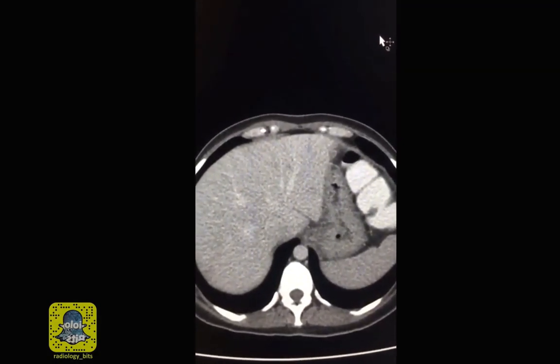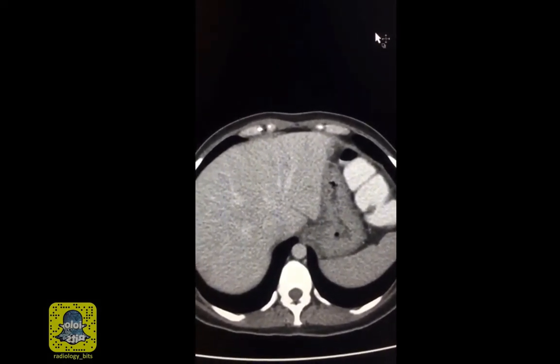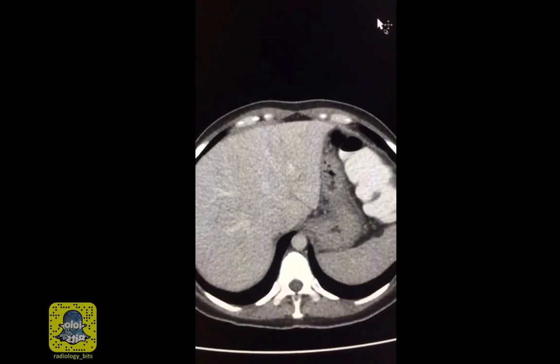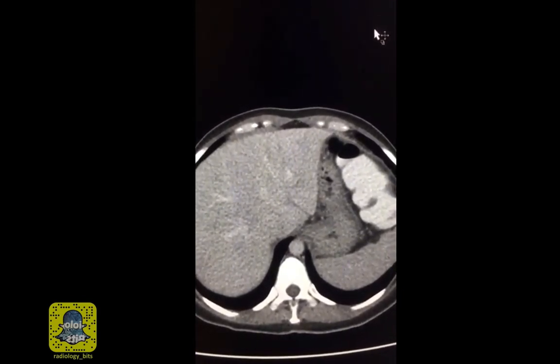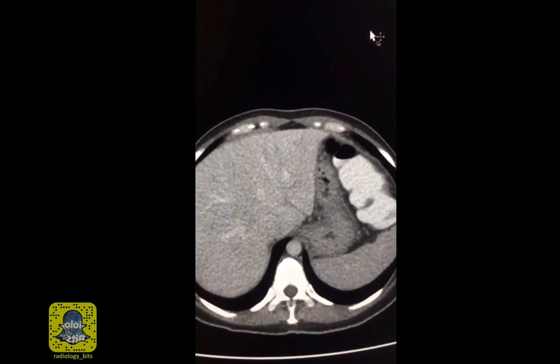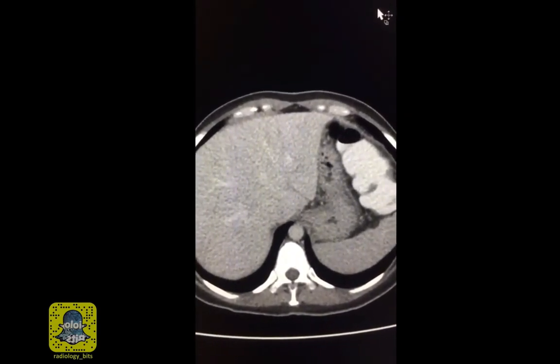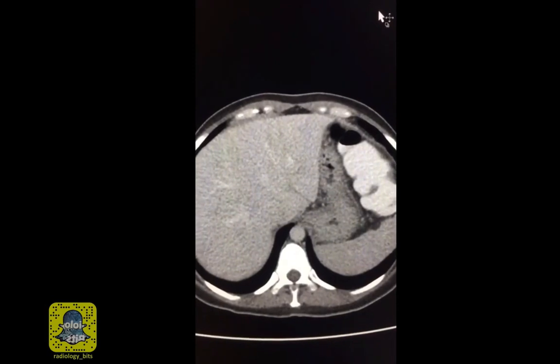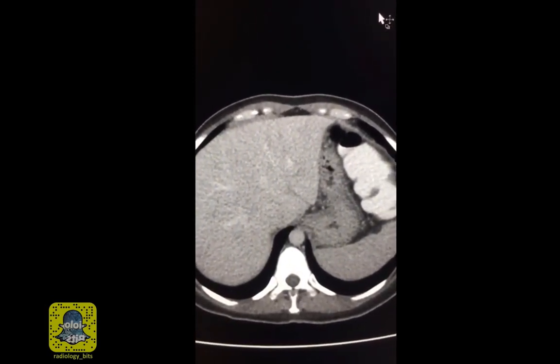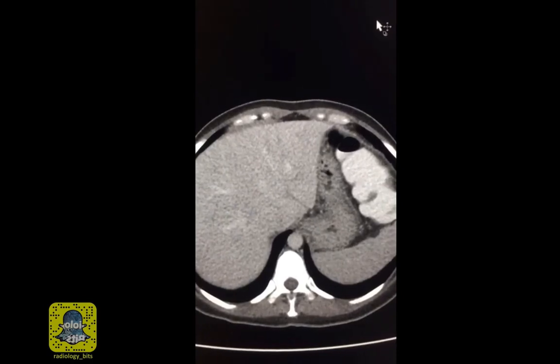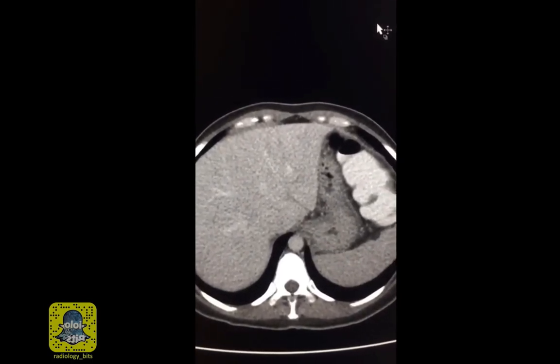This is a good case set to show several simple teaching points. The case has multiple findings — all everyday bread-and-butter findings that a radiologist may face. This is a good case for students to get a sense of what a radiologist may see every day, and also a good case to review a few basic concepts for radiology residents, especially the junior ones.